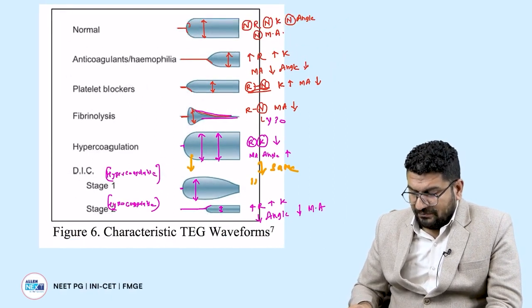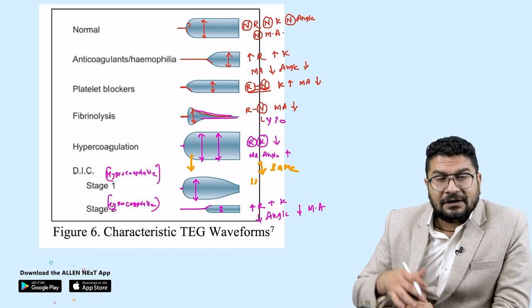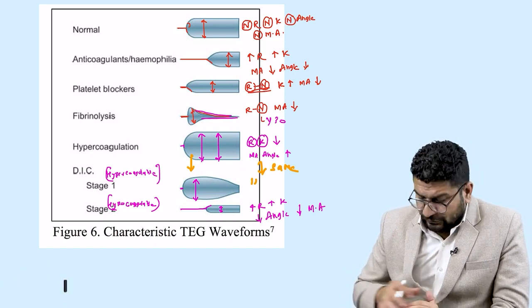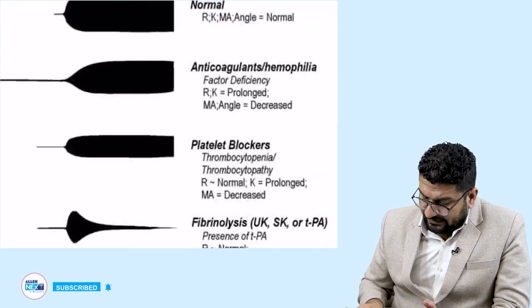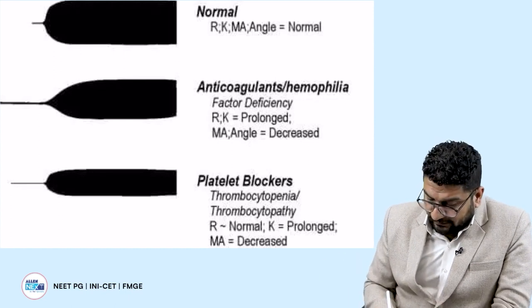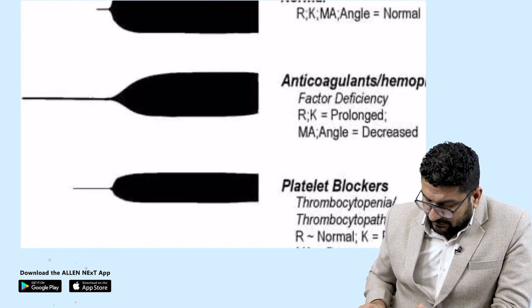So यही image based question exam में बार बार पूछते हैं. They will give you a certain image and they will ask you like what is this thromboelastogram representing. So if you know all these components, so this is again you can notice here. यहाँ पर आप फिर से देख सकते हो. अब मैं आपको just short में बता रहा हूँ. You can notice here everything is normal.